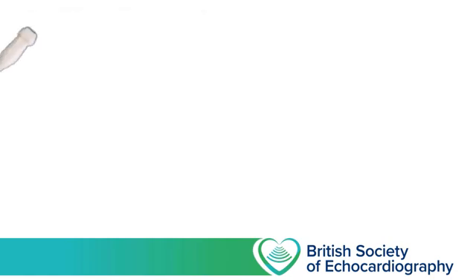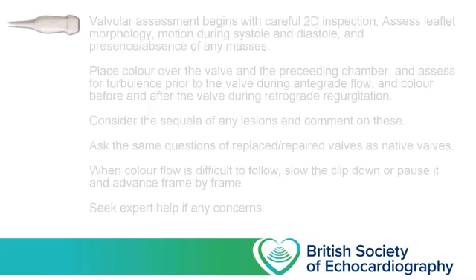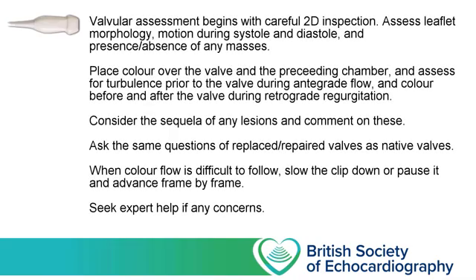Okay, so that concludes everything that I wanted to cover in this lecture. So first of all, well done for getting to the end of it, and before we finish, let's quickly summarise those key points. So first of all, like with everything in echo, start with your 2D.